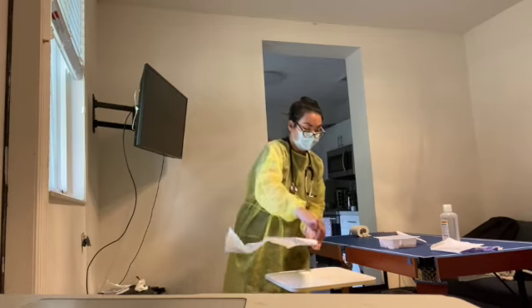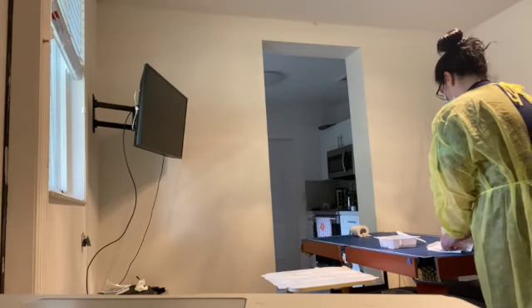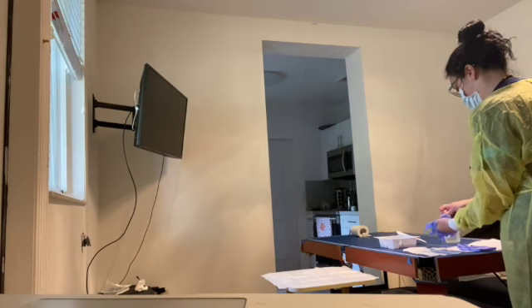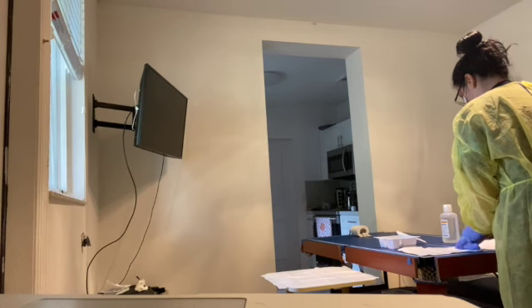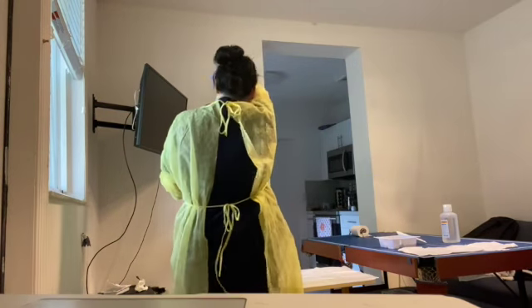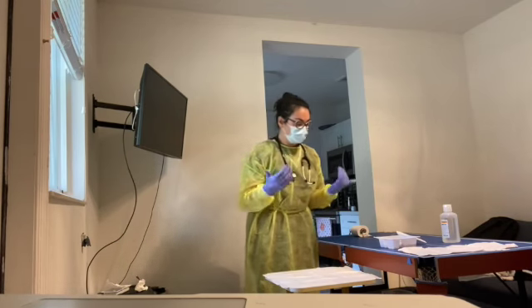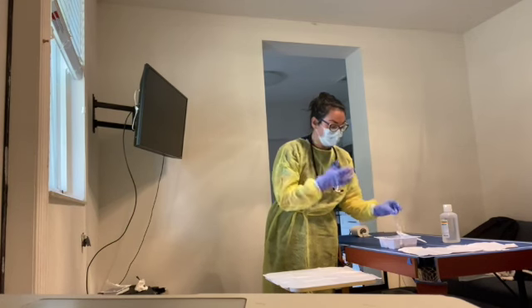Okay. And I'm going to wash my hands and don sterile gloves. Okay. And at this time, my sterile gloves are in place. I'm going to walk back to my sterile field. Sorry about that, that was an accident. I'm going to walk back to my sterile field. I'm going to place all of my materials out of it.